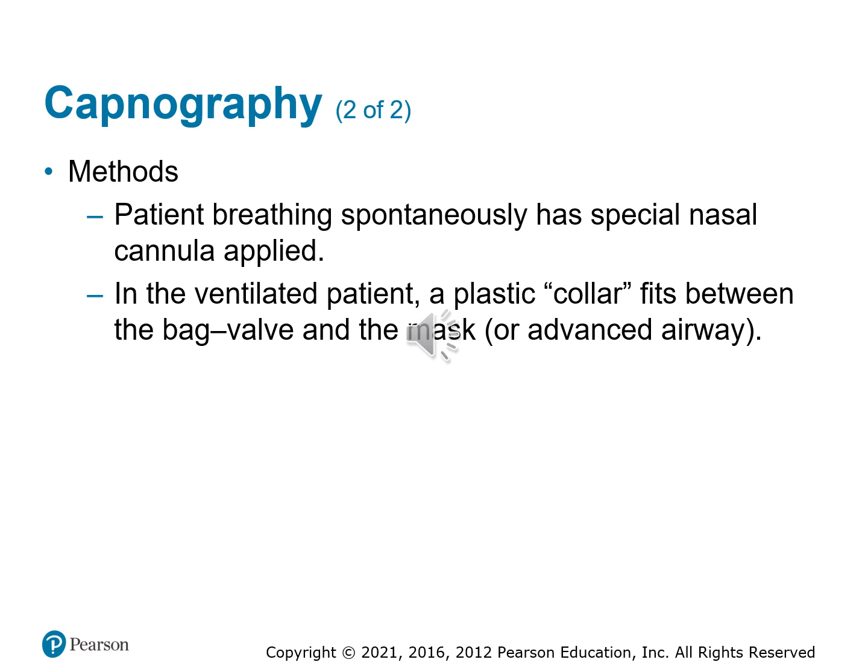The way that we measure with this, there's a couple different ways. So in the airway chapter, we're going to learn about nasal cannulas, which is the oxygen delivery device that goes in your nose. There's basically a little cup underneath of that, so when the patient exhales, the air introduces into this little cup, and then it runs through a sensor and a piece of equipment that you have. Ours is in our cardiac monitor, and then that piece of equipment will determine what the measurement is and display it on the monitor for you. That's for a patient that's spontaneously breathing.